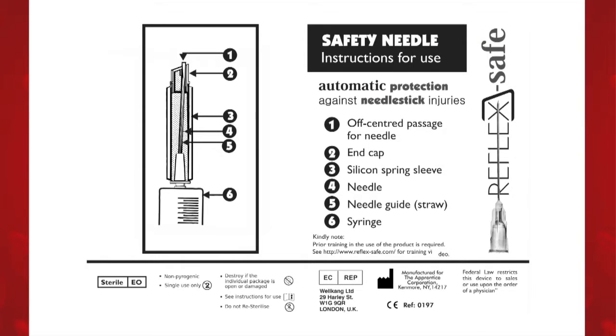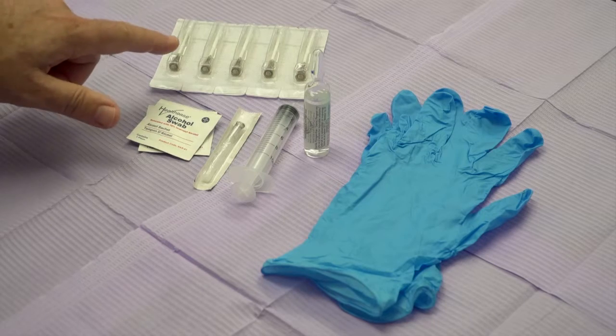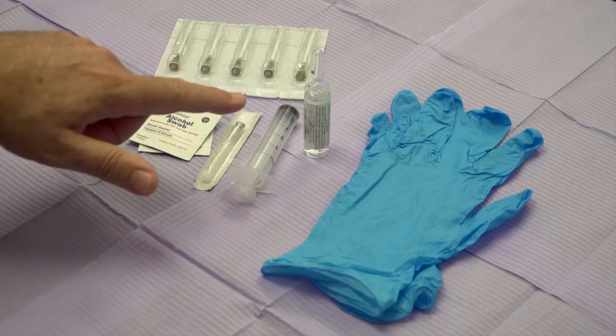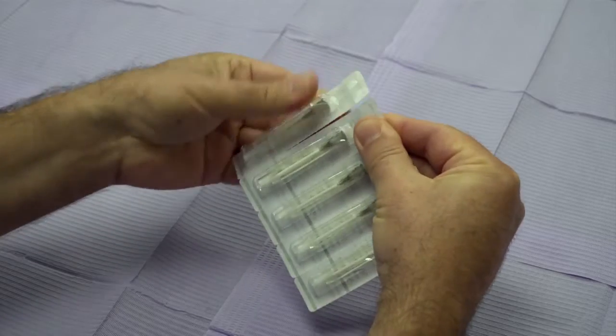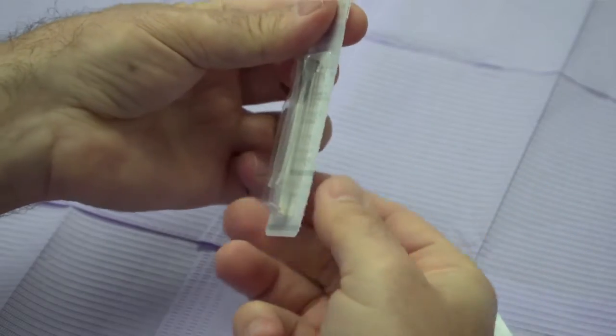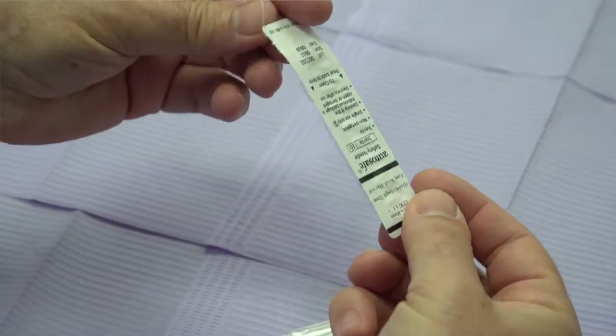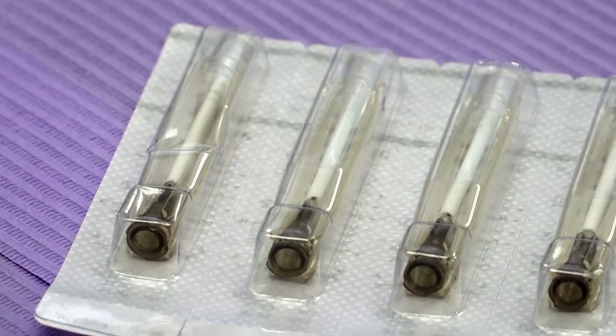View the diagram of the needle with its various parts. Prepare and collect all items for the intended clinical procedure as per standard operating procedure. Select an appropriate gauge and length Reflex Safe Needle. Inspect the outer package for any damage. If damage to the package is noted, discard and replace with a needle from an undamaged package.